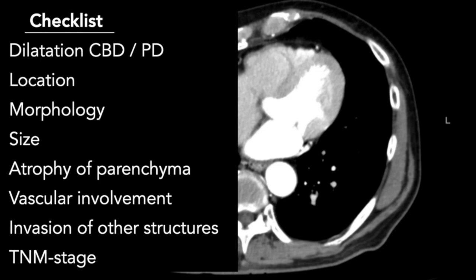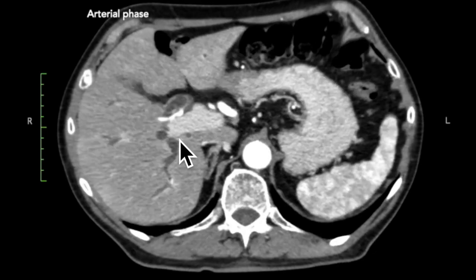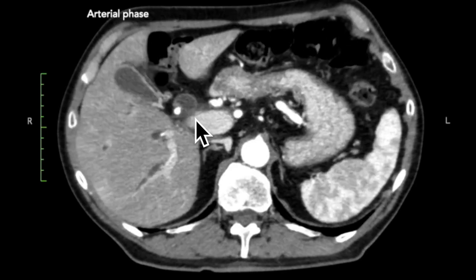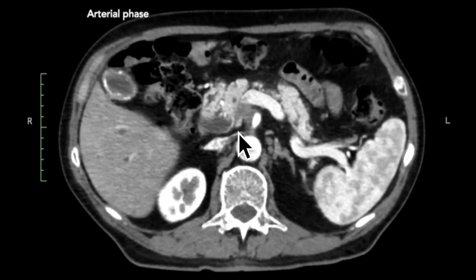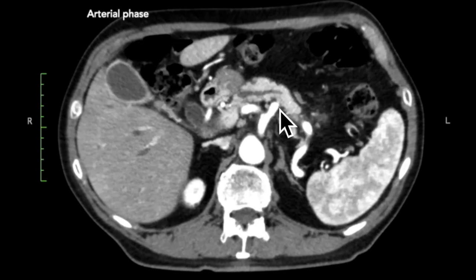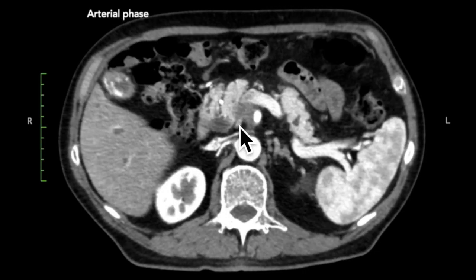Identifying the location of the tumor first — clear dilatation of the bile ducts, intra-hepatic and extra-hepatic, following the common bile duct. There is an obstruction at the head of the pancreas. Looking at the main pancreatic duct, it is dilated to a lesser degree, mainly here. Following downstream, there is an obstruction here as well.